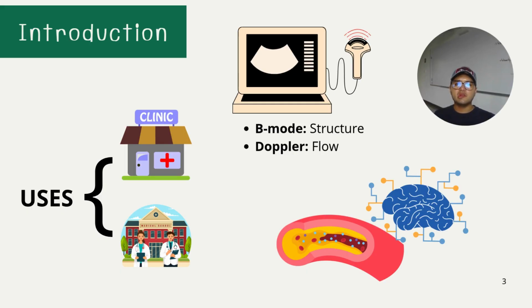Phantoms have two main uses: the clinical one, where it is used to help train clinicians to identify vascular diseases such as an aneurysm or stenosis in an artery in a safe and repeatable setting. The other one is the educational one, where in medical schools and labs it is commonly used to teach anatomy and sonography.